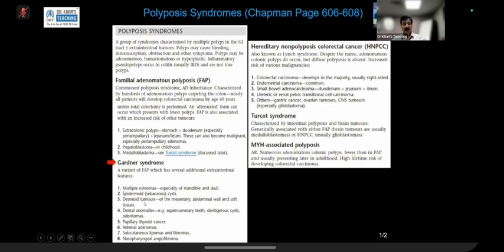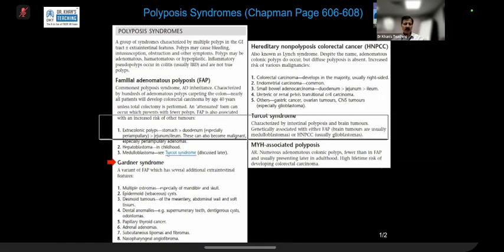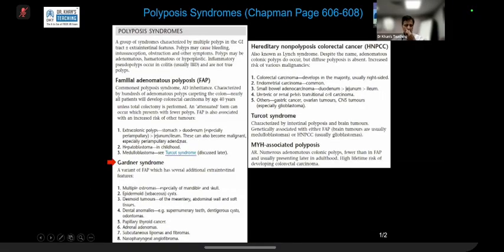And there are other entities which can happen. One is osteoma of the skull and PNS. Another one is desmoid tumors. And desmoid tumors can be in many places: mesentery, abdominal wall, soft tissue. So the key point is that desmoid, remember the word, just like a fibroid, will be low signal on T2 weighted sequence.